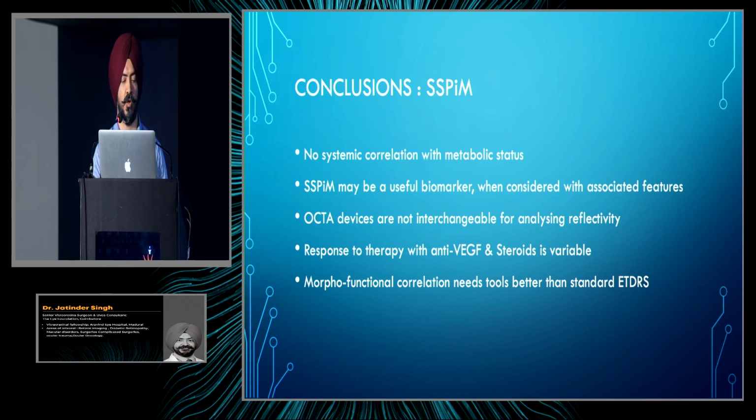OCTA devices are not interchangeable for analyzing reflectivity. Response to therapy with anti-VEGF and steroid is variable, and there is no clear-cut evidence of the superiority of one over the other. And morphofunctional correlation associated with SPiM needs better tools than ETDRS visual acuity. Thank you so much for your kind attention.